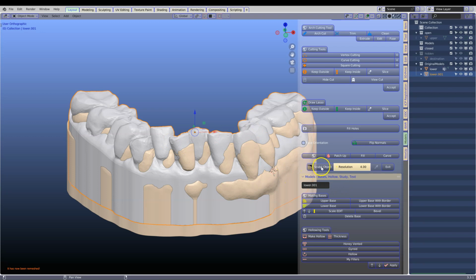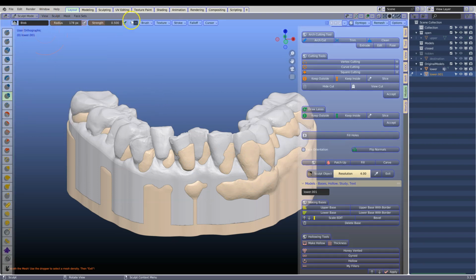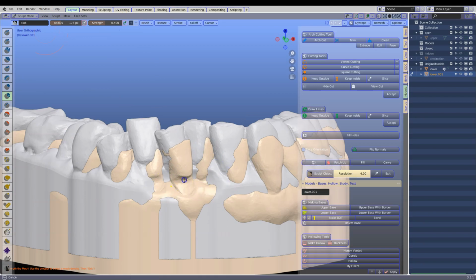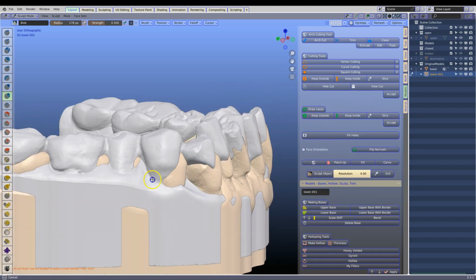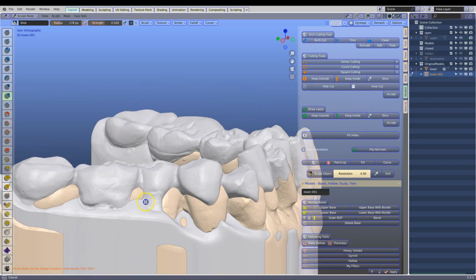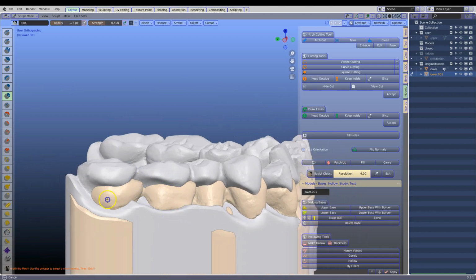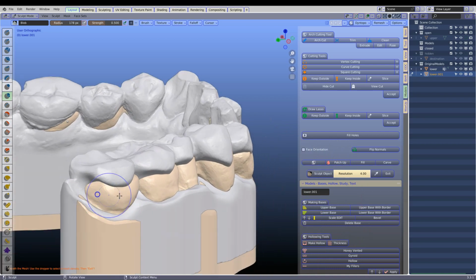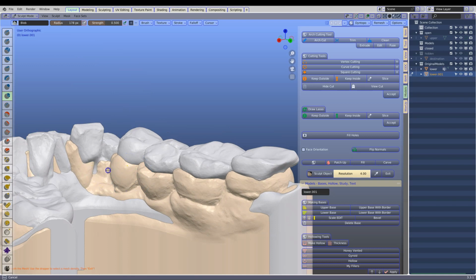In the model designer, I'm going to go to the sculpt, and we're going to sculpt and push this mesh into the other model, the orange model. So I'm using the blob tool on the negative. This pushes it inward. Now I've got to ensure that all of the model is pushed in, so we've got a separation between the occlusal surface and the bottom of the model.